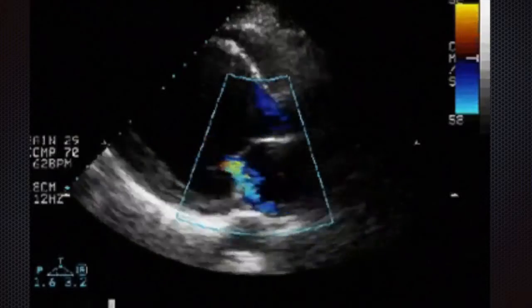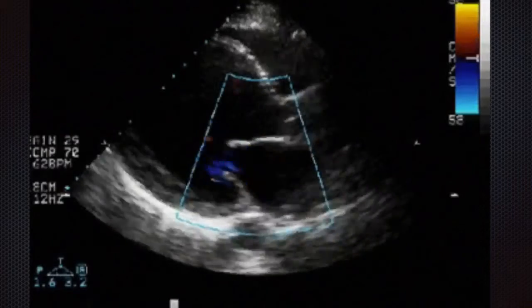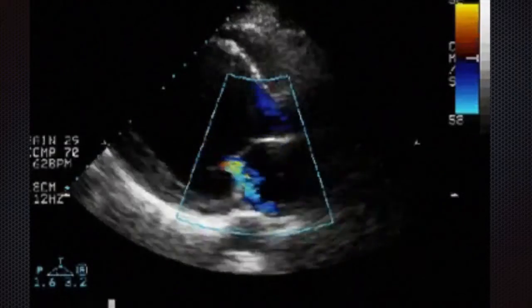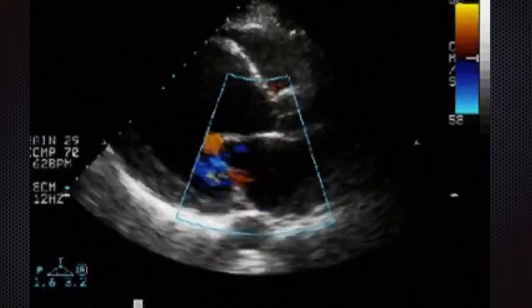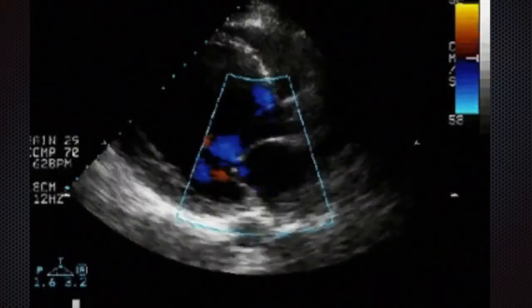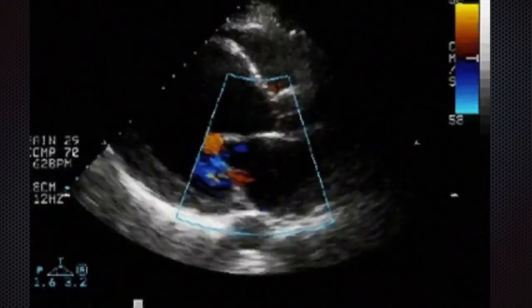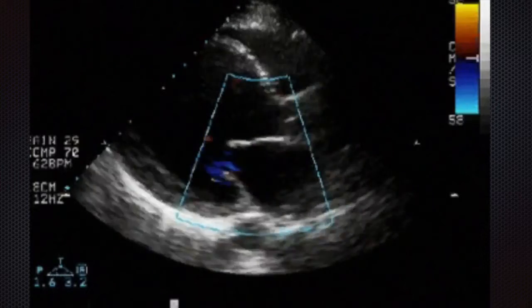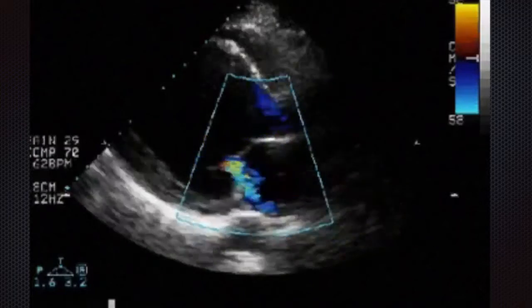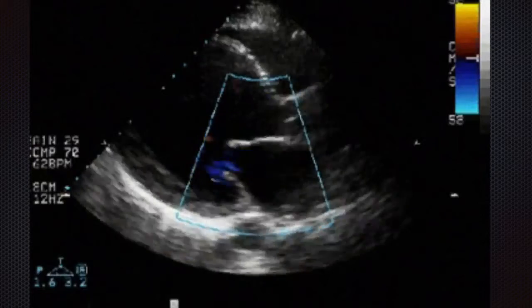So when we look at something like this, you see with the mitral valve, the blood is coming back during systole, and the regurgitant jet must be quite narrow, so it's showing up as mixed colours with a little bit of greening, which would indicate that this is quite turbulent flow. So when it's not turbulent flow and not at grossly high velocities, you would expect it to be more of a typical blue or red.